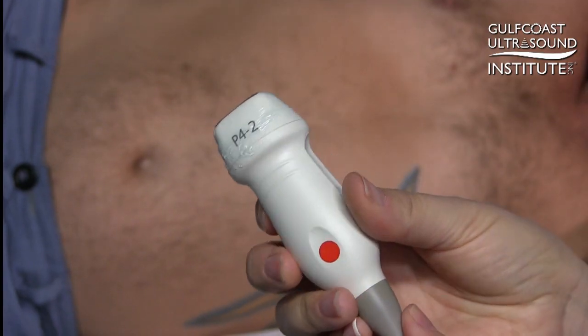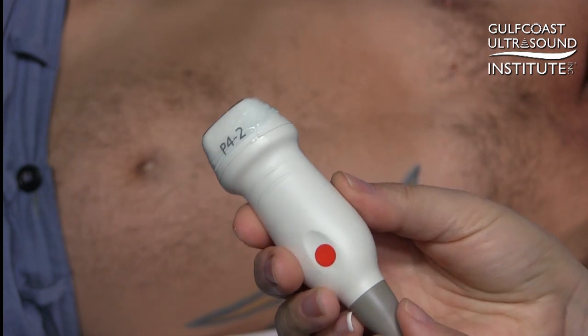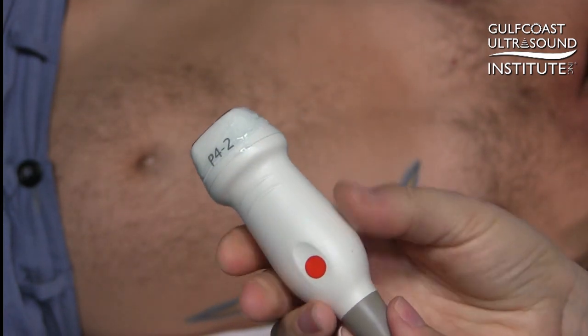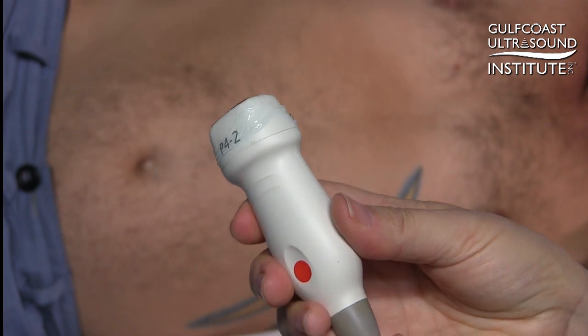Turning your transducer in this motion — a 360-degree circle — should give you the capability of getting all of your views. And that's your hot tip for the day. Now you try dialing in your apical views.